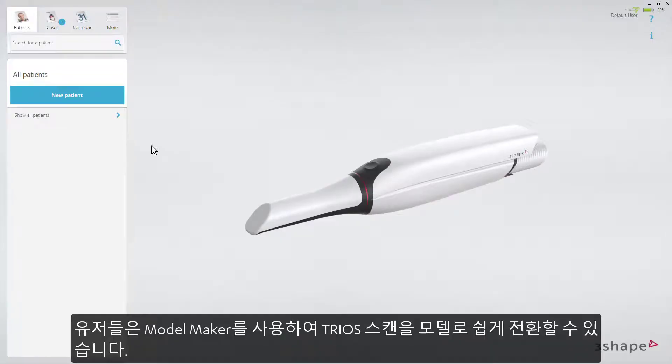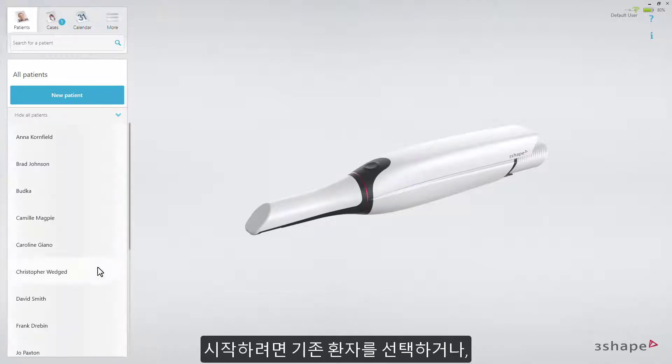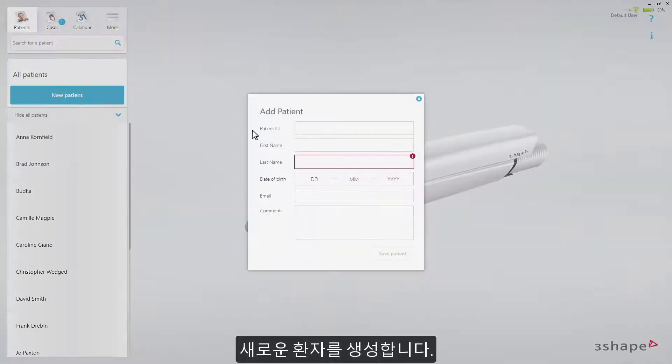ModelMaker allows users to easily convert Trio scans into models. To start working, choose an existing patient, or create a new one.